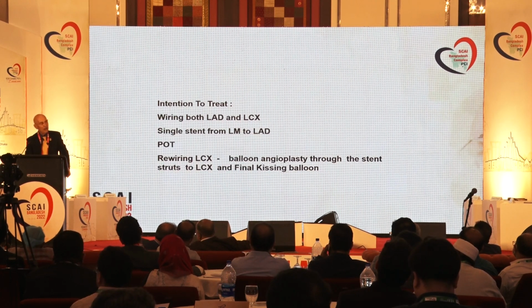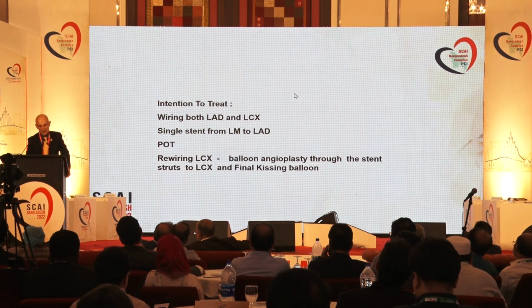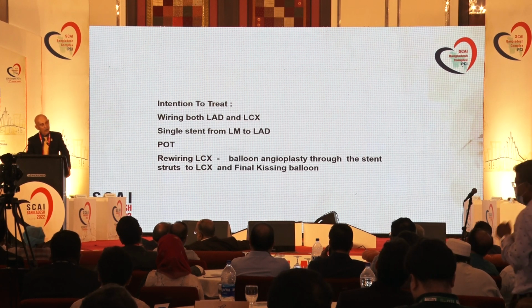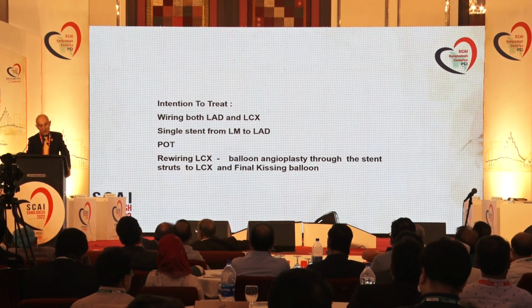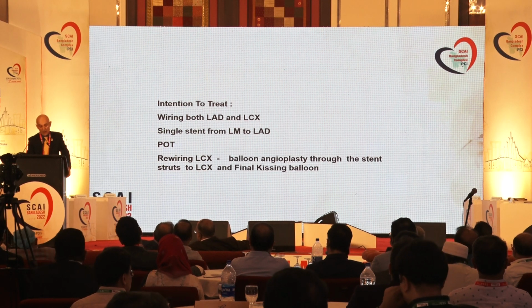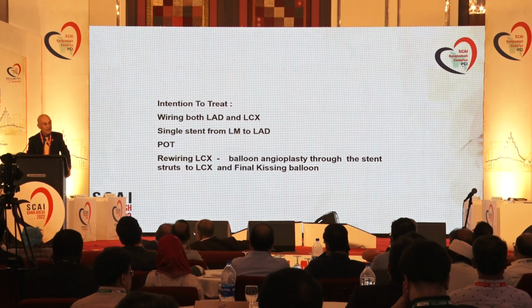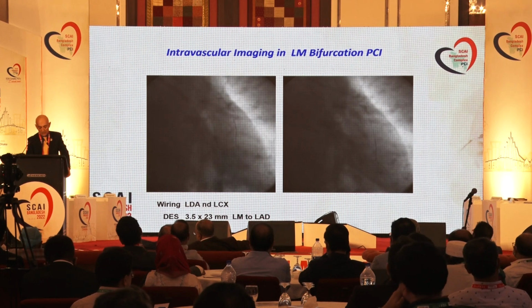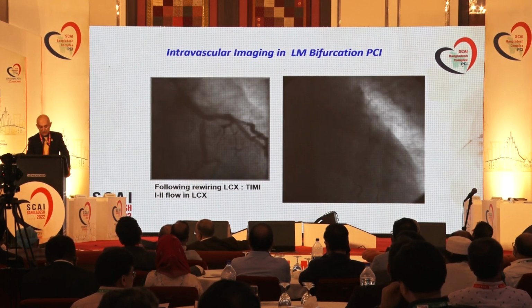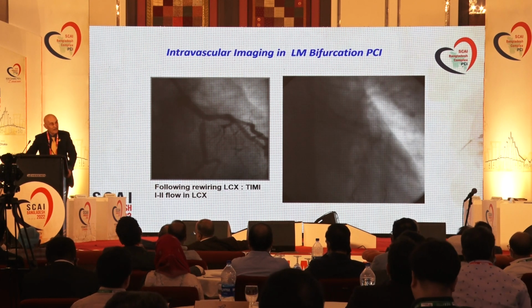So the intention to treat in this patient, again, was classical provisional stenting: wiring of the lesion, pre-dilatation, lesion preparation, single stent from left main to LAD, and POT, rewiring the circumflex, balloon angioplasty through the struts, and final kissing balloon if needed. Again, here are the steps.